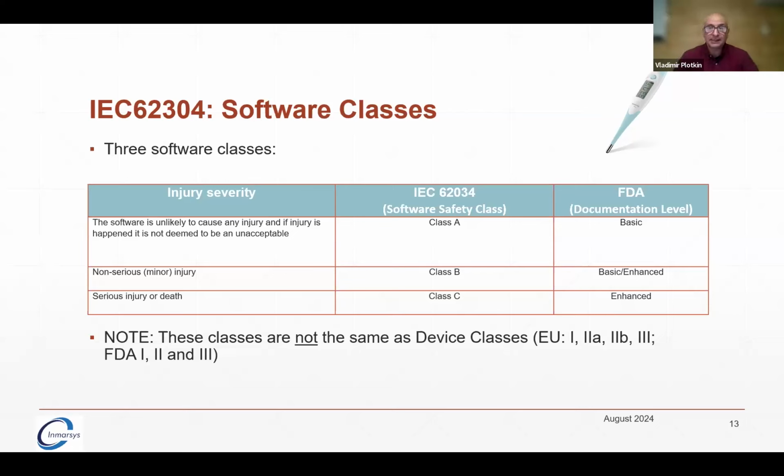So those who answered "depends" are actually correct. There is such a thing called IFU, instructions for use. And these instructions for use outline the intended use of the thermometer. So if you are, for example, going to a supermarket and buying this thermometer, it's highly likely the instructions for use will say it's not to be trusted.